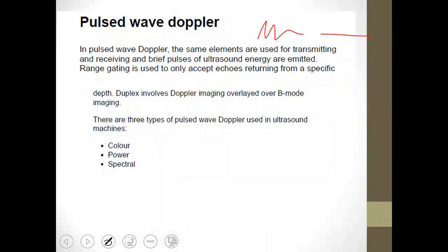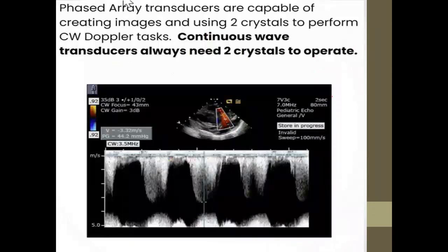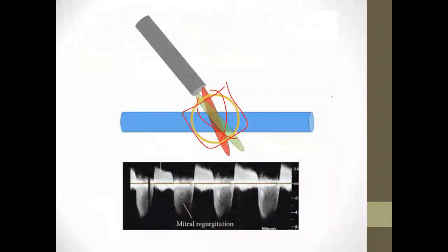To measure the flow, what do you really need? So what exactly will it work on? It will work on what it receives. It can detect whether there is flow or not. Is this the area where the interference happened? I'll give you another picture. So, is this the area where the interference occurred?